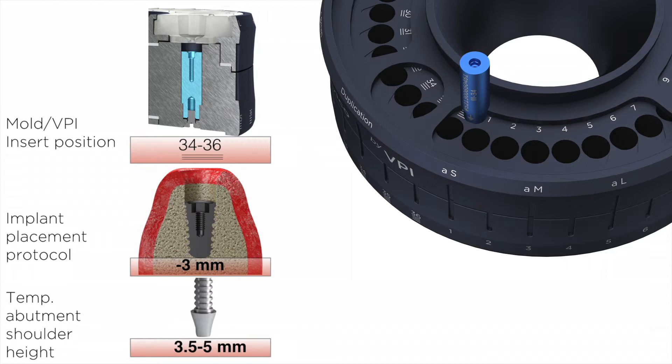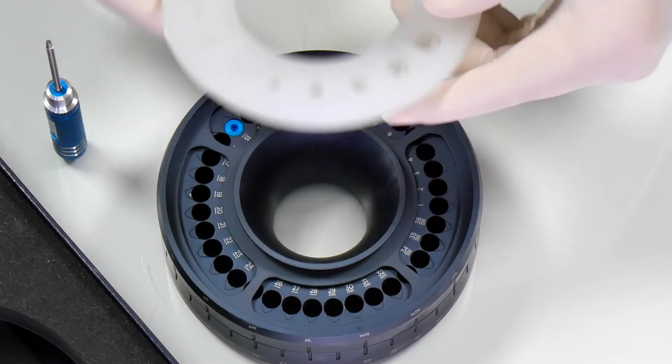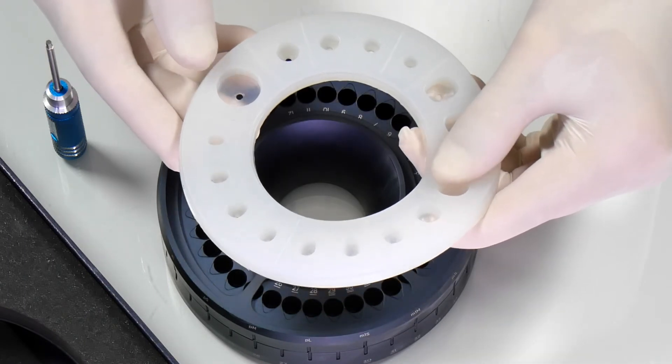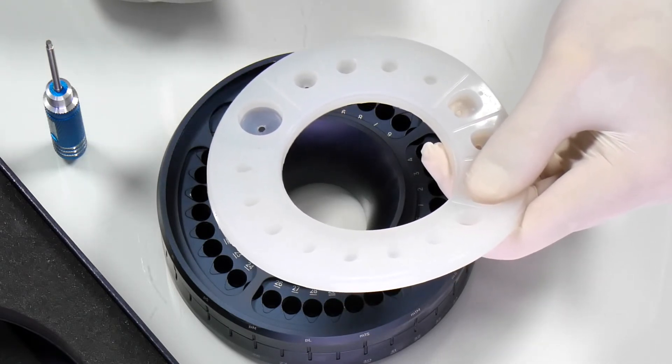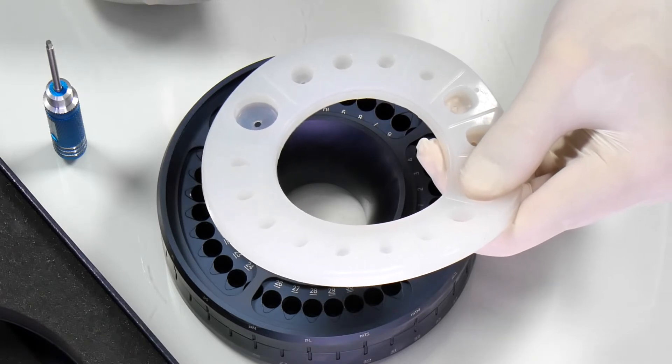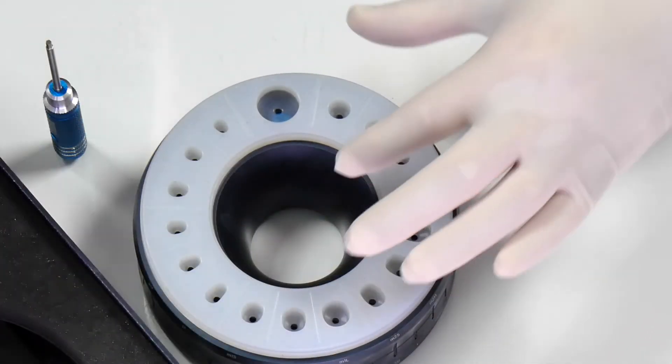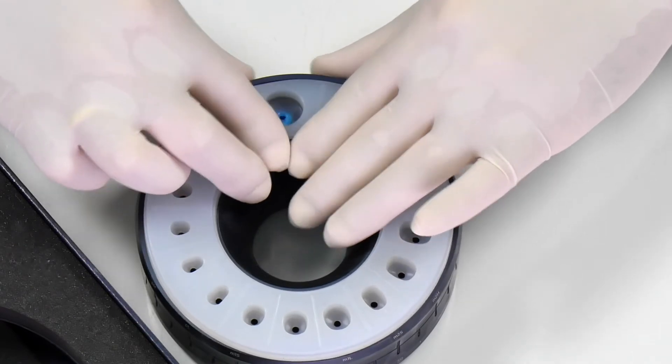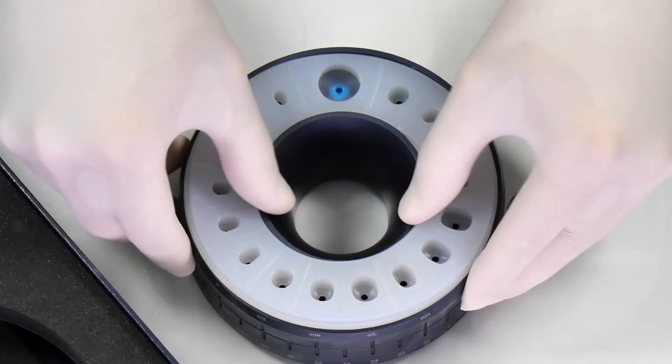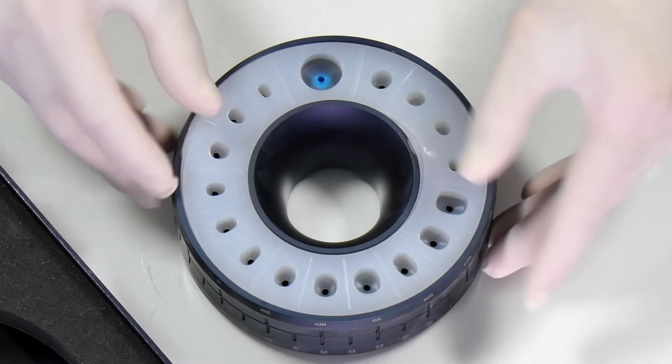Now you can take the silicone insert and align the duplication well with the socket that resembles the duplication well on the top ring of the mold. Once the two wells are properly aligned, you simply push the silicone insert into the base of the mold.